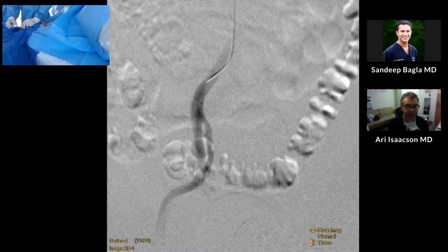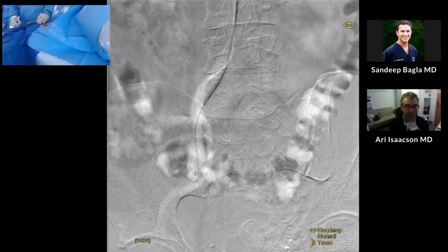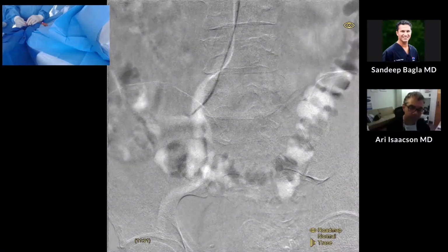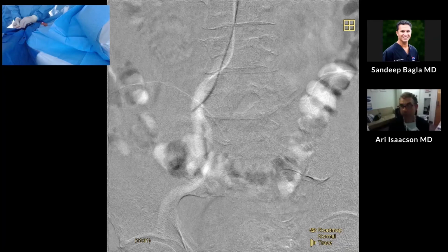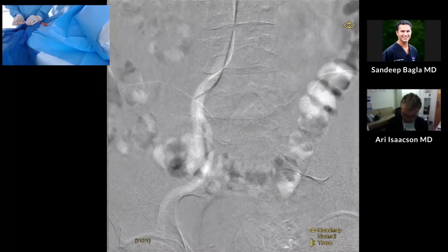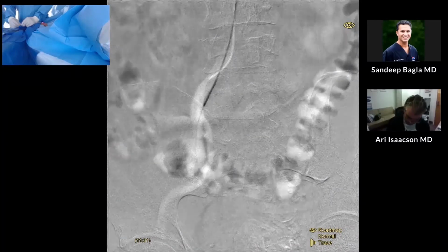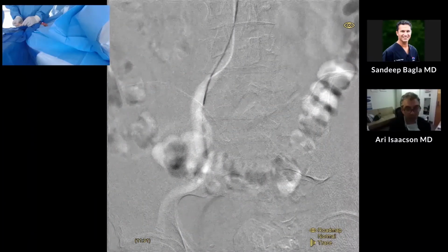I think we won't have a problem getting in, but very, very rarely you'll get hypogastric arteries which are really tortuous. And from a radial perspective, for example, it can be a little bit challenging, even when you get down the thoracic aorta to the pelvis, to say, hey, let's get into this hypogastric artery. There are certain catheter wire shapes and configurations you use for those patients who have really sharp, or acutely angled, origins to their hypogastrics. Yeah, so looks like you got in there.